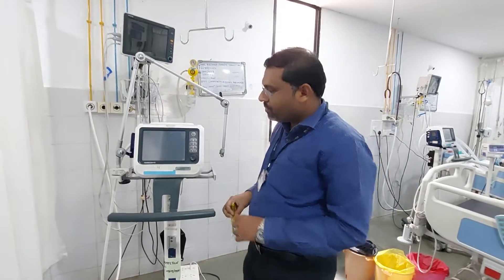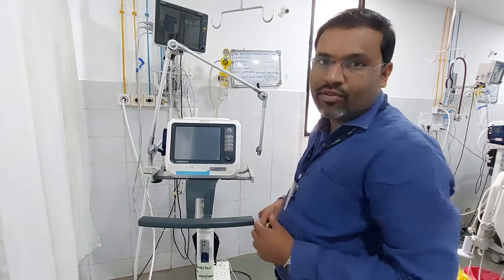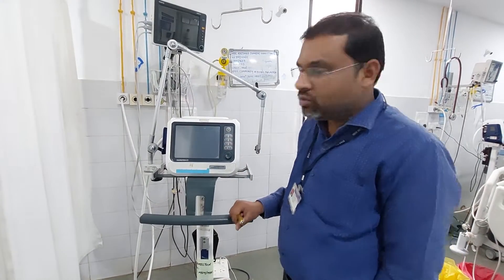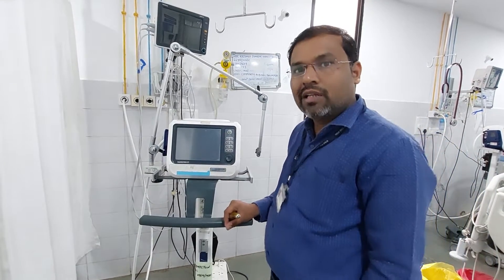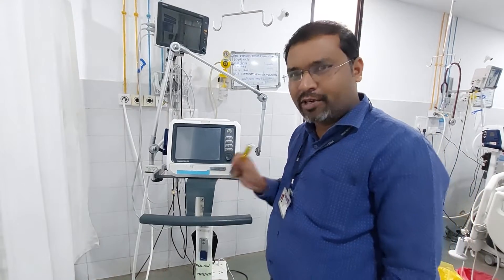Hello guys, today I am going to make a video on how to replace the O2 cell of the Hamilton C1 ventilator. Sometimes what happens is the machine will not show you the FiO2, or by doing the calibration of FiO2 the O2 cell still will not show you FiO2. That is when we need to replace the O2 cell.